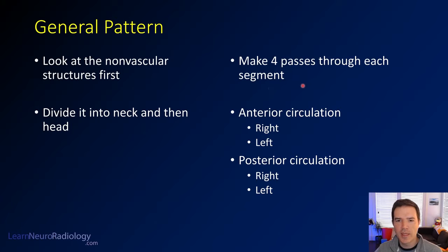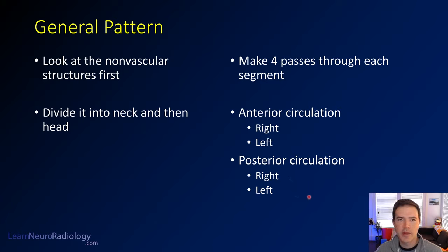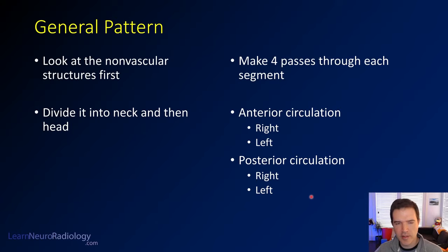You're going to make four passes through each segment, so you're going to look at each vessel separately. That's what it really takes to be able to see all of the abnormalities. I take a look at the anterior circulation first and look at it from right to left — the right internal carotid, then the left, then the right vertebral artery, and then the left. That's what I recommend for you as well.